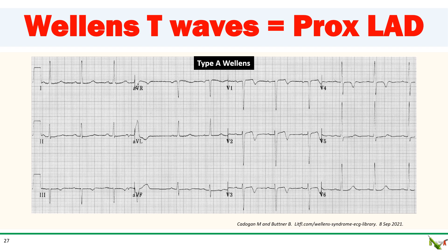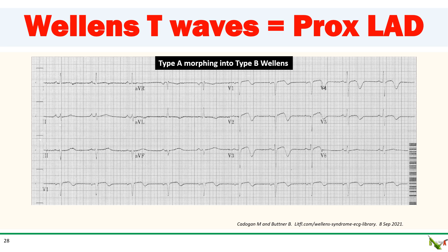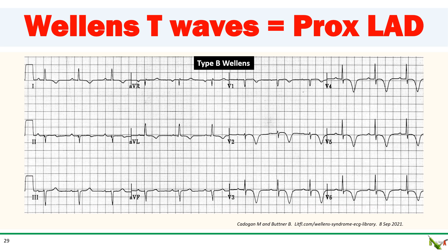Here is a classic example of Type A Wellens. You see the biphasic T-waves in leads V2 and V3. The R-wave progression is normal. There is no LVH. You're also starting to see a little T-wave inversion in lead V4 as well. Here you see more of a transition from Type A to Type B — you still see the biphasic T-waves in V2 and V3, but the T-wave inversion is more prominent, and you also see deeper T-waves in V4 as well as a little in V5. The R-wave progression is normal. Here we see an example of Type B Wellens with deep symmetric T-wave inversions across the precordium with some T-wave inversion in the lateral leads. Notice the R-wave progression is still normal and there is no LVH pattern.